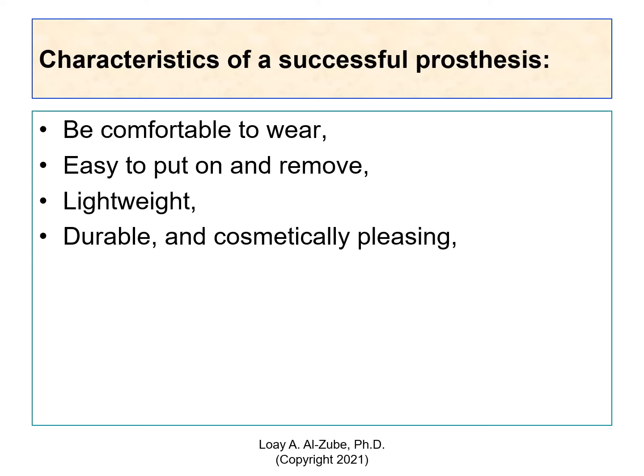What do you think is the most important mode of load? Mode of loading would be, for upper extremities, tension, and for lower extremities, compression. And that's how you do the testing for each one of them. Cosmetically pleasing, aesthetic, it's now becoming a thing. We need to be really considering a beautiful design.